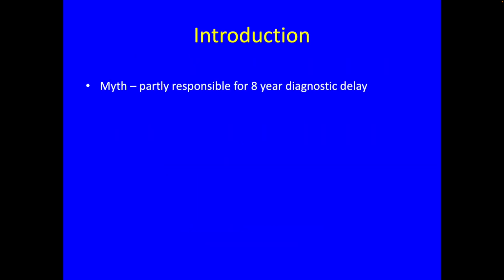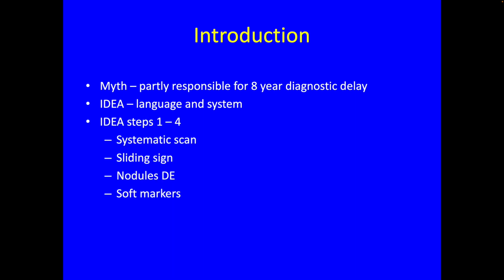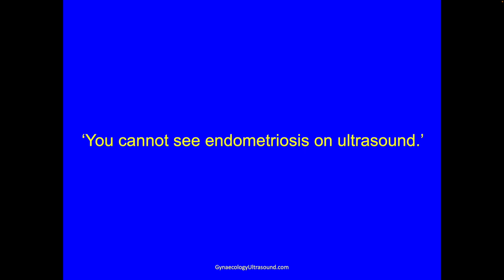In this talk, I'd like to dispel a myth that's, I think, at least partly responsible for the 8-year diagnostic delay of endometriosis. I'll talk about the IDEA language and the system with the steps that they've recommended, perform a live scan, not really live, and share some resources. The myth is you cannot see endometriosis on ultrasound.